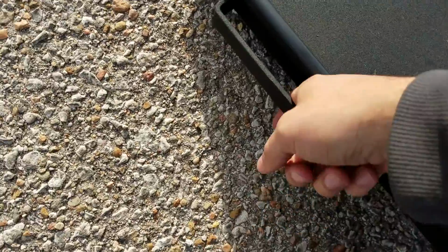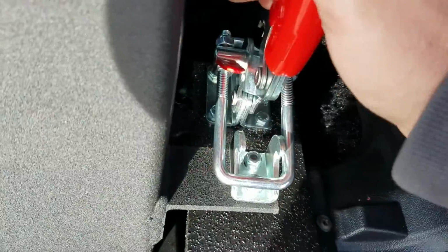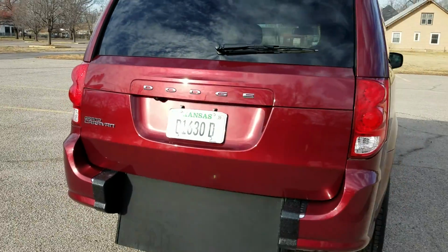And when it's time, get everybody secure, come back out, look at that, one finger. Take the ramp back up. Latch it down. And shut her down, and you're ready to roll.